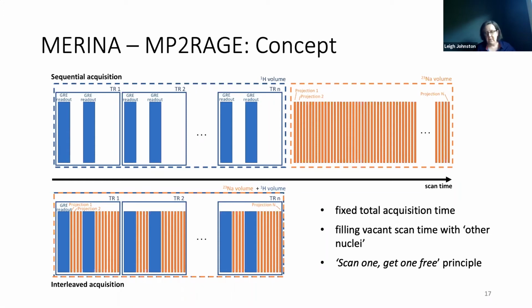So we talked to our good friends at Siemens, and we have a really nice, close working relationship with Siemens. And we say, okay, so we want to apply two different excitation frequencies in the same scan. All right, so we want a B1 field that's turned on at 300 megahertz, and we want to then closely interleave it with something that's turned on at 78 megahertz. And they're kind of like, well, actually, you can't do that until you get our next upgrade.